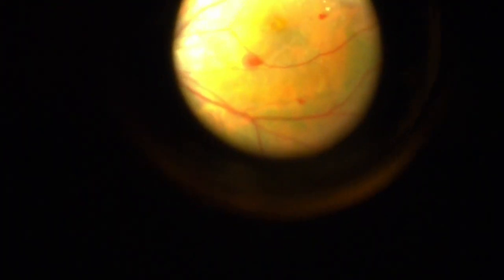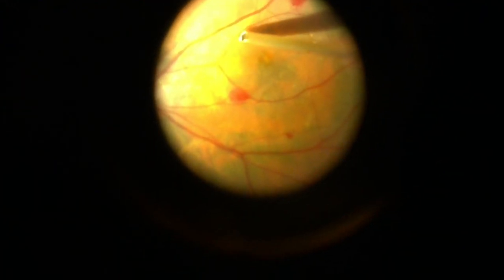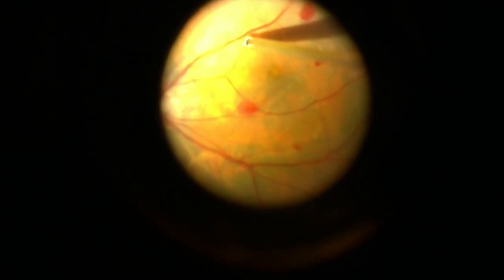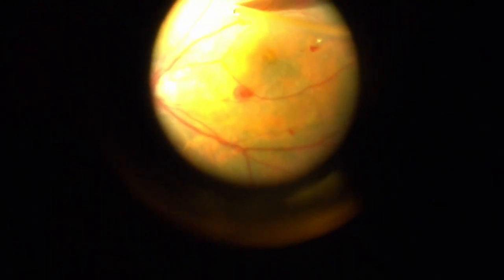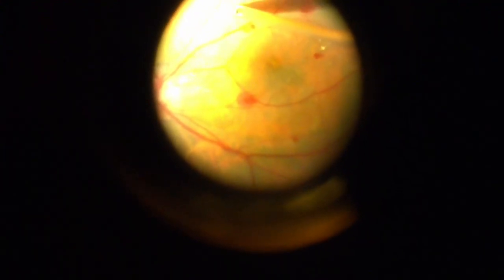And I would definitely caution that if you're starting that technique, you want to be away from the central macula. If you do engage the retina, you want to know where your reflux is. So I'm not going to engage the retina here purposely, but I will show you the reflux piece. I find that very helpful. So I stop. If I engage the retina right there, I would kick it over and you hear the machine go click and it spits it out.